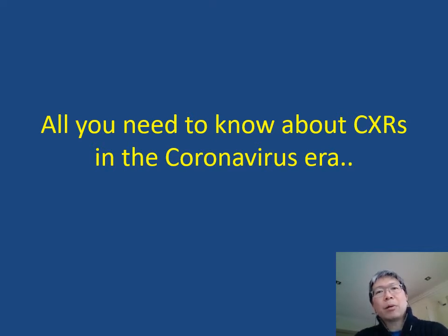We are in the midst of a severe coronavirus outbreak, and many of you have volunteered to support our frontline staff in managing patients with the condition. Some of you may have felt a little nervous or concerned about the skills to interpret the chest X-ray in these patients. Over the next 10 minutes, I hope to tell you all you need to know about chest X-rays in the coronavirus era.